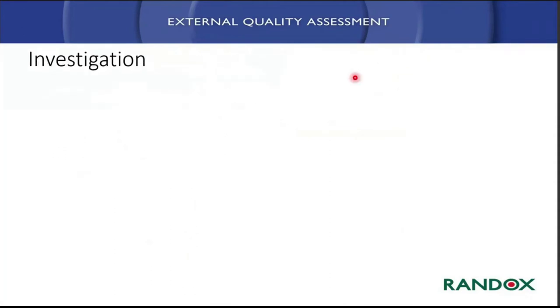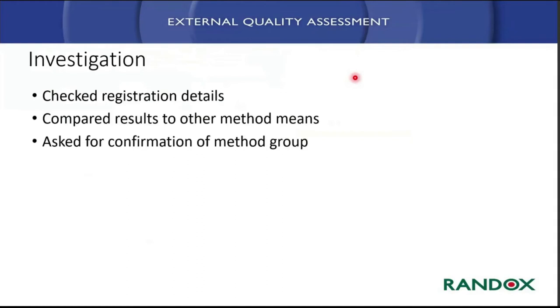Now, we did some investigation with them. First of all, because they were running a separate EQA scheme, we wanted to be sure that the two were comparing like-for-like. So we wanted to check that they were correctly registered. Obviously, if you're not correctly registered in any EQA scheme, you may be compared to the wrong consensus mean or the wrong target value. So that's important to start with.